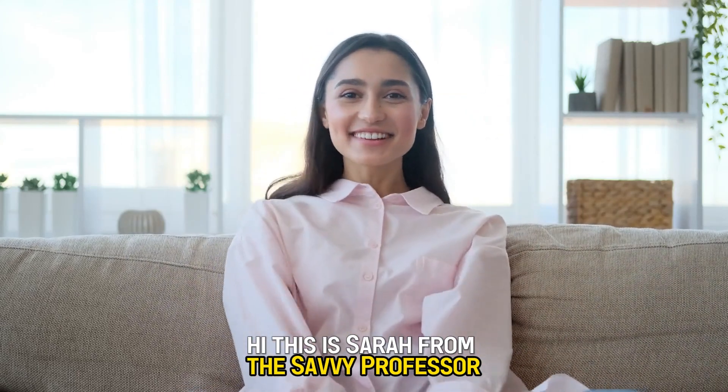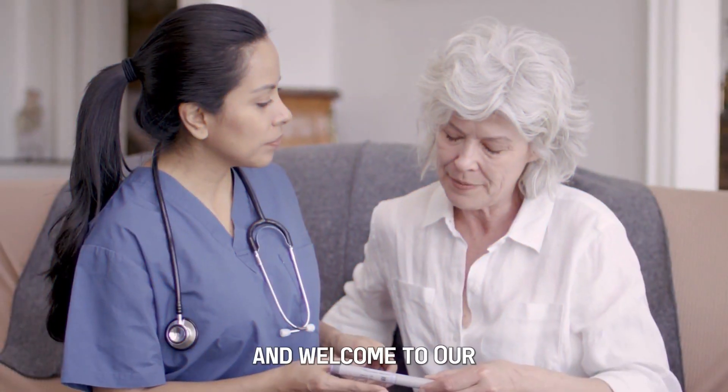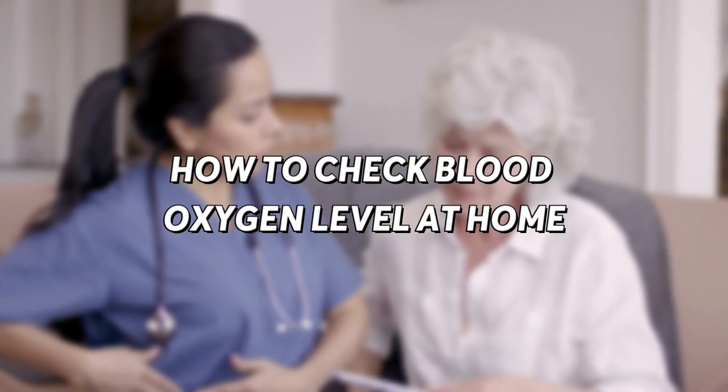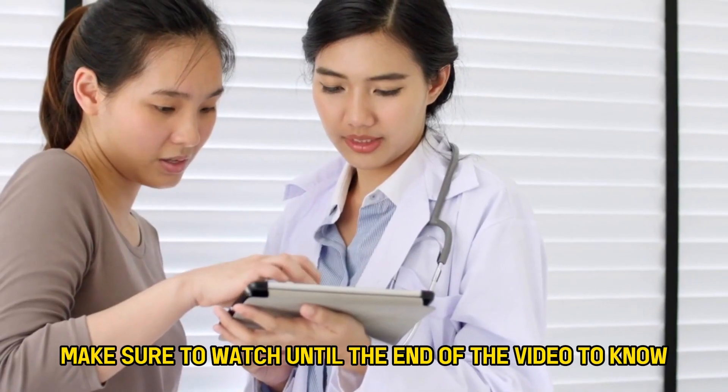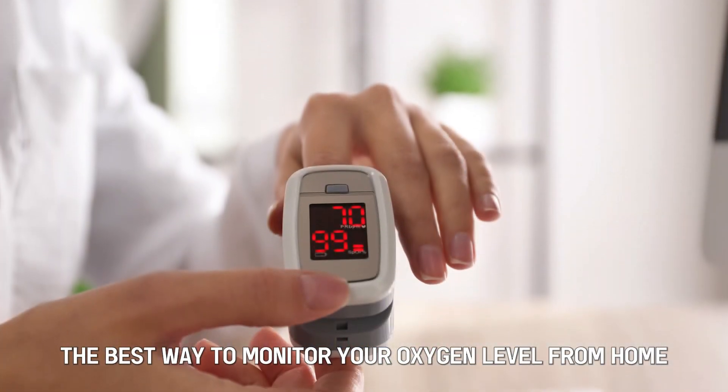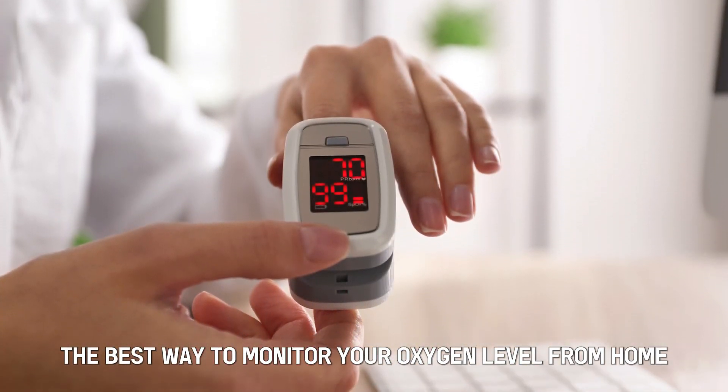Hi, this is Sarah from The Savvy Professor, and welcome to our video on how to check your blood oxygen levels at home. Make sure to watch until the end of the video to know the best way to monitor your oxygen level from home.